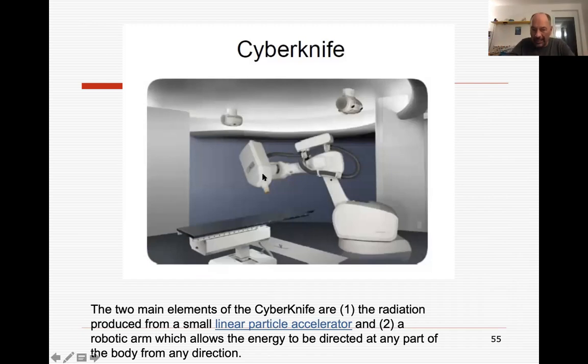You see, it's the head of an accelerator, and can also provide very, very high doses, and is particularly useful when you have moving targets, because of course the accelerator can synchronously move to irradiate the moving target, like a lung, when you have a large movement, while this is not possible in VMAT or in tomotherapy.